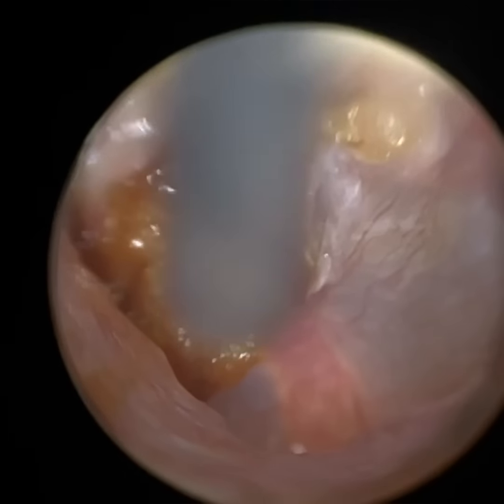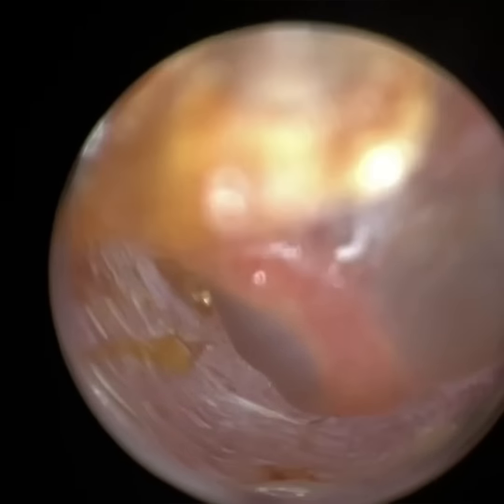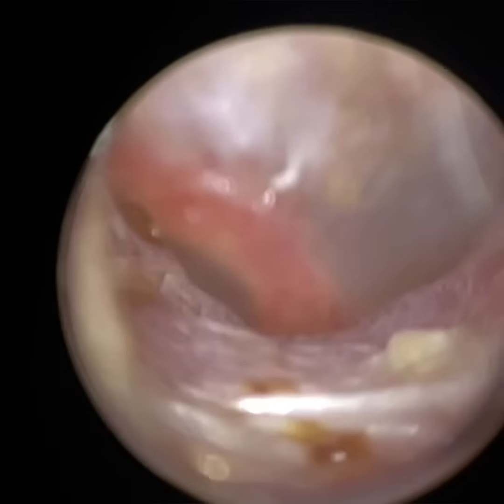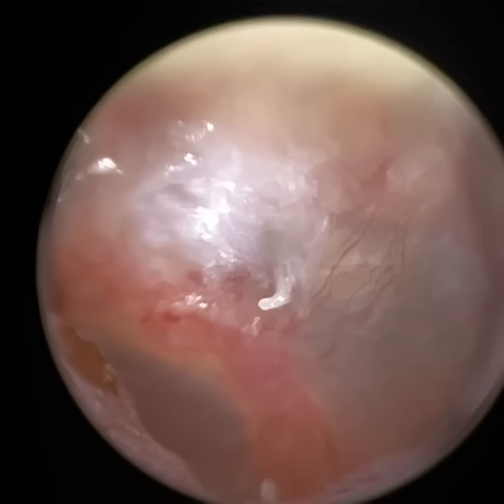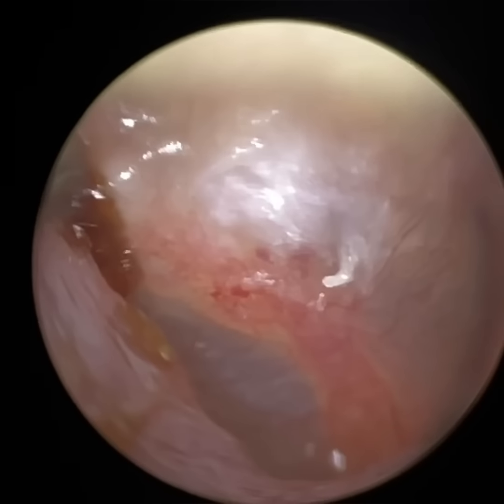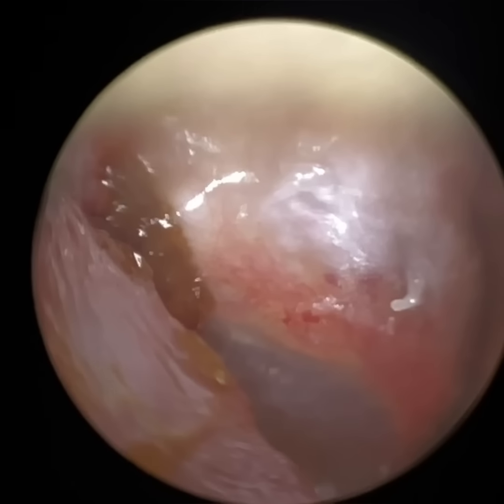It's on the anterior part of the ear canal. Again, this can be quite typical with Keratosis obturans. You get a lot of dead skin formation on the eardrum. There's just some residual skin, which I was very pleased that I could get actually with the WAXscope in the anterior recess. I'm just reducing the exposure slightly there. You can see it's just in the corner. It's just obscuring the view of the short process of the malleus, so the hammer bone, the top part.